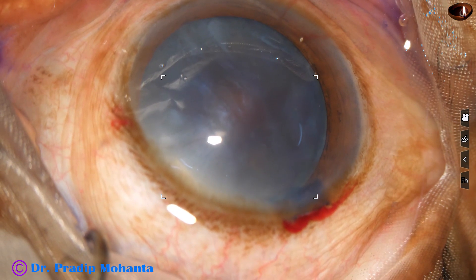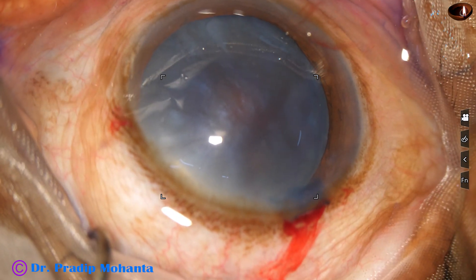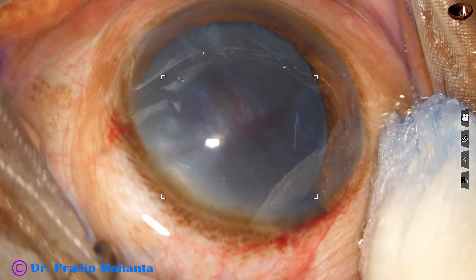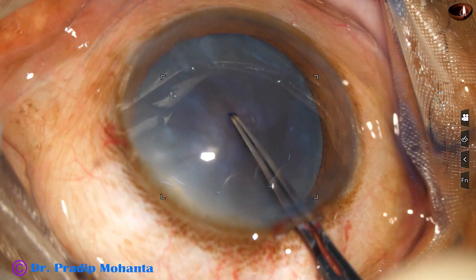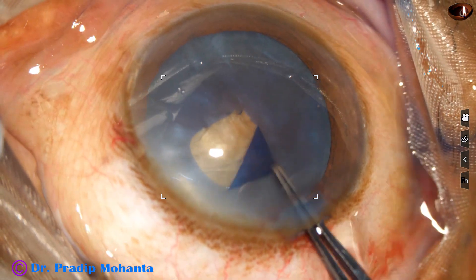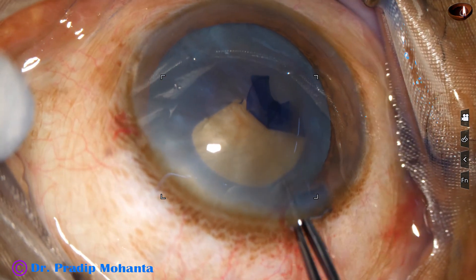The anterior chamber has been filled up with 2% hydroxypropylmethylcellulose. Now I am going to do capsulorhexis. A utrata forceps is taken and a capsular tag is raised.